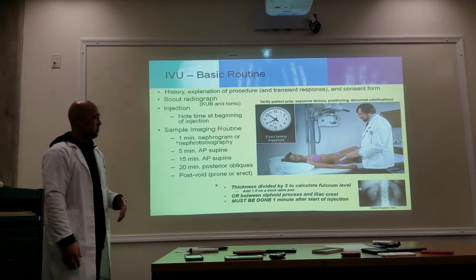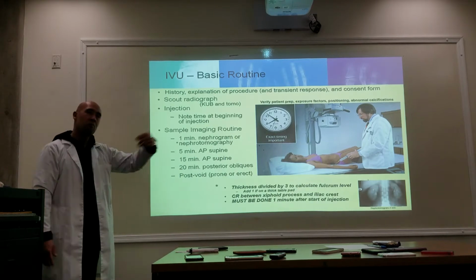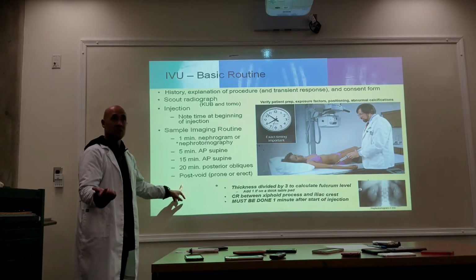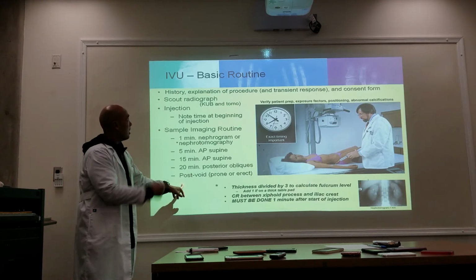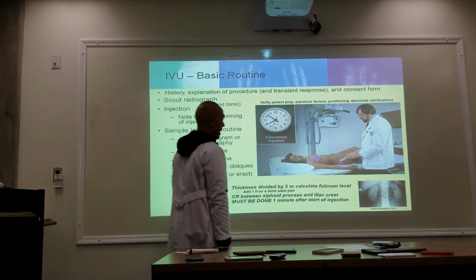Okay? And then lastly, when the doctor says, go ahead, we're done, you have them go pee, and then you take your last shot, which is your post-void. Just like your post-void in the VE, you also have a post-void in your IVU. And again, it depends on the protocol. Are we going to shoot it on the table?